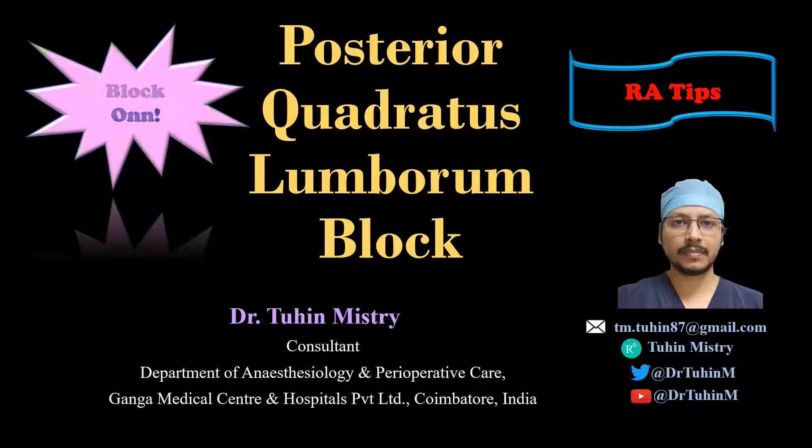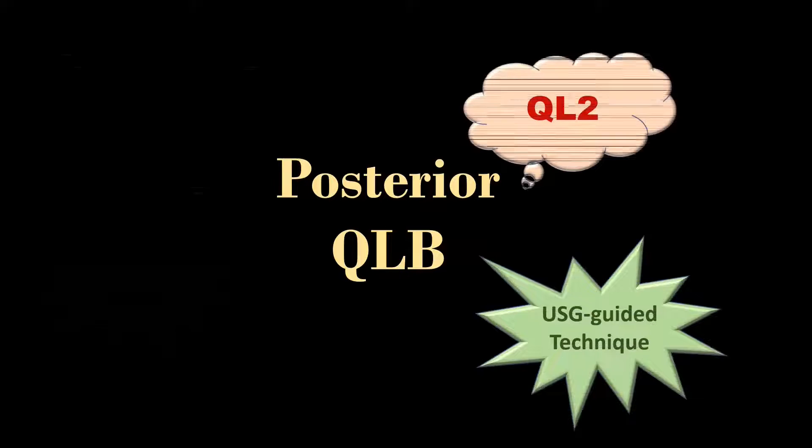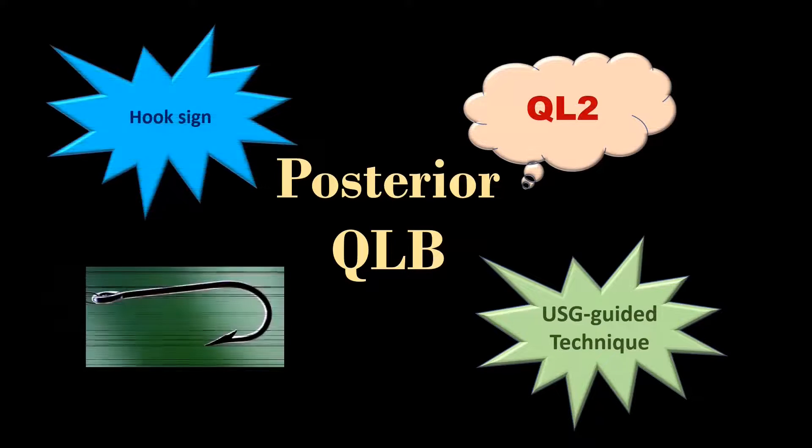Hello friends, welcome back to another episode of Block On. In this video, I am going to demonstrate the ultrasound guided posterior quadratus lumborum block, which is also known as QL2, based on the hook sign.